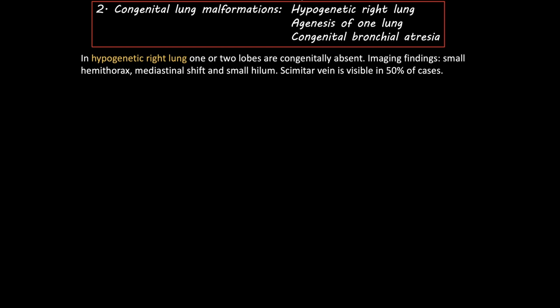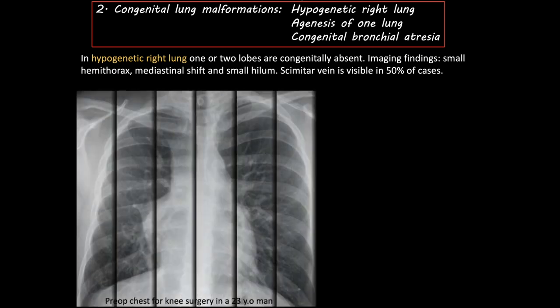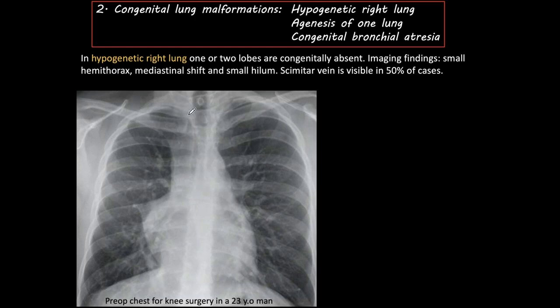In hypogenetic right lung, one or two lobes of the right lung are congenitally absent. The imaging findings are a small hemithorax, mediastinal shift, and a small hilum. The scimitar vein is visible on plain film in about 50% of cases, so if you suspect this abnormality you have a 50-50 chance of diagnosing it on the plain film. Here is another case — also a hypogenetic right lung with small right hemithorax, mediastinal shift, apparent slight dextrocardia, and especially the abnormal vein, which if you see it clinches the diagnosis.